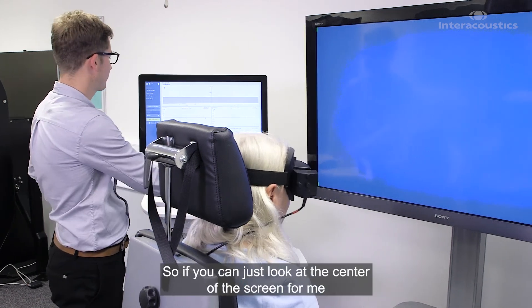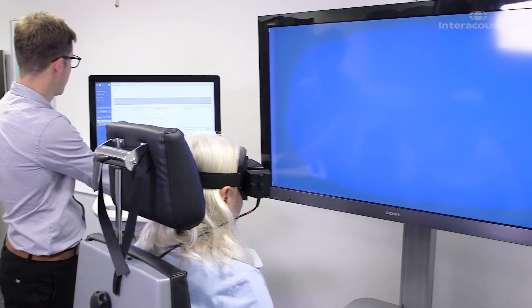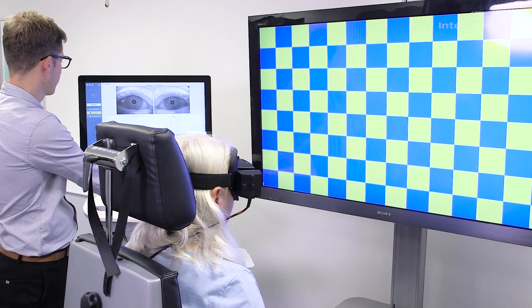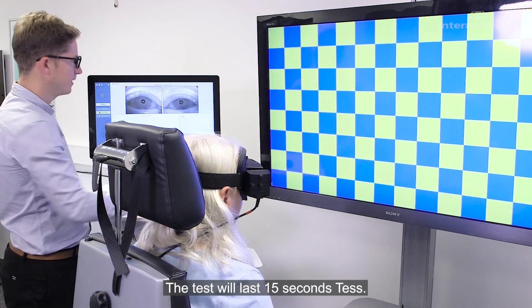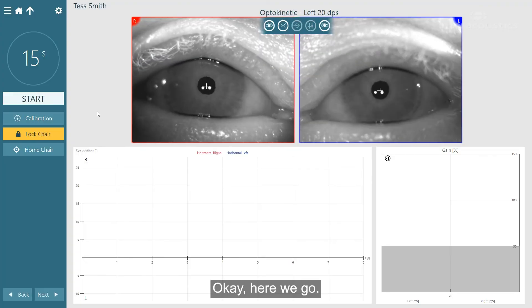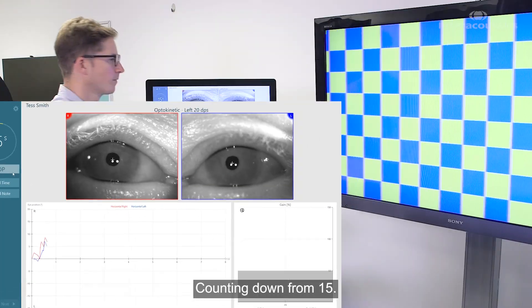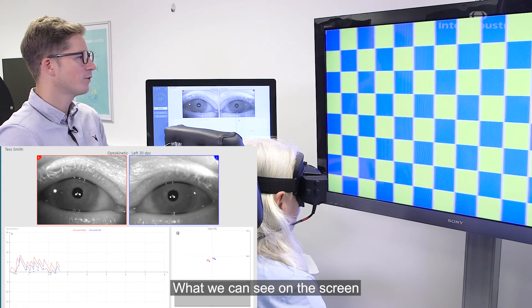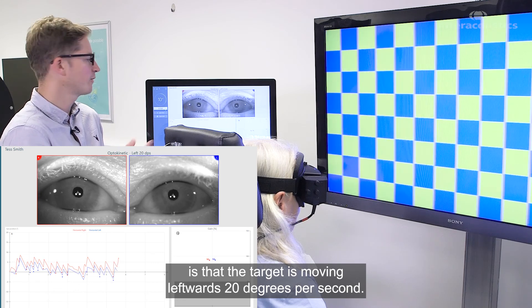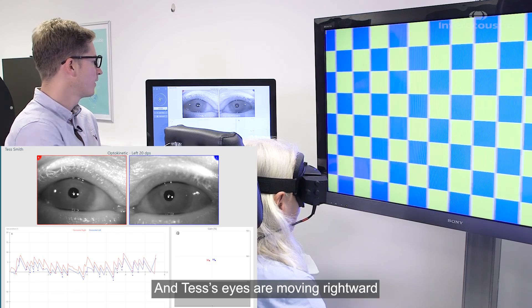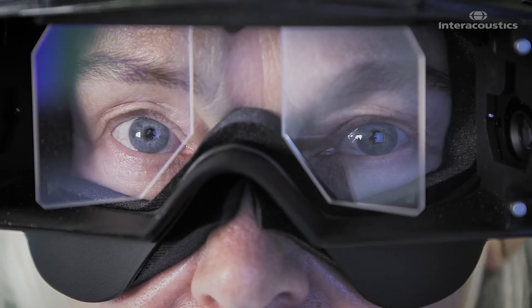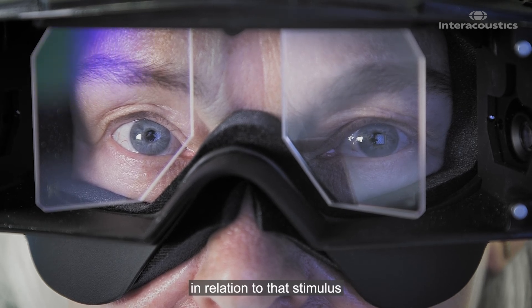If you can just look at the center of the screen for me, we can go from there. The test will last 15 seconds. What we can see on the screen is that the target is moving leftwards at 20 degrees per second, and Tess's eyes are moving rightwards in relation to that stimulus.